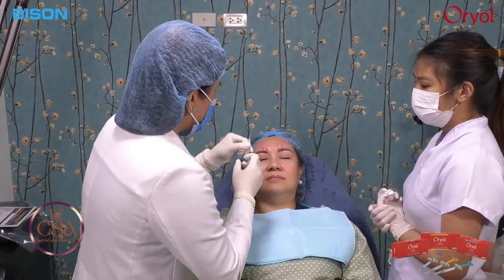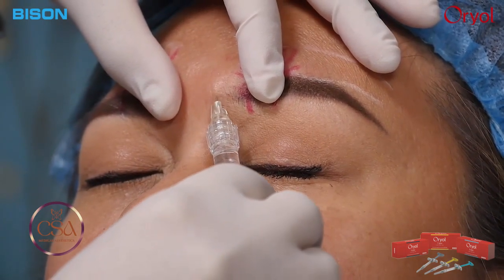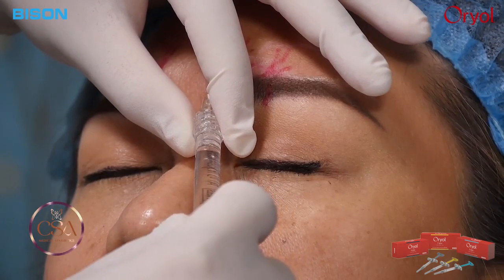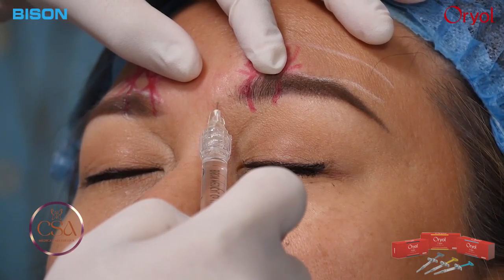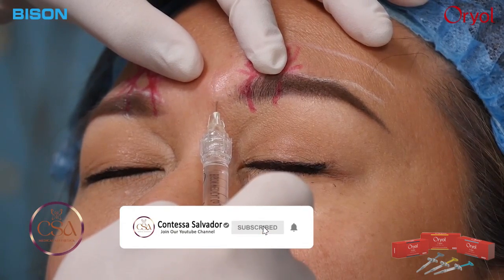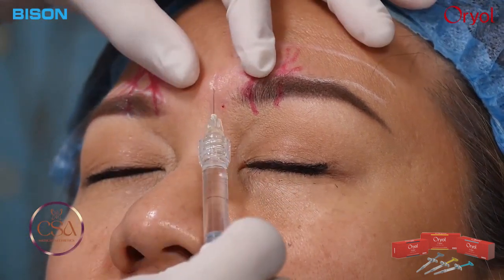So I'll start with the left aspect there, okay? So the inferior line there, just superficial layer 2. I still do some aspiration, okay? It's just my habit, although it's not necessary. Again, fill in this part here, just a minimal amount, no need to overfill. You can use like 0.1 in this area here, okay? Just push the product. And then after that, we can also inject at the superior aspect of the line.